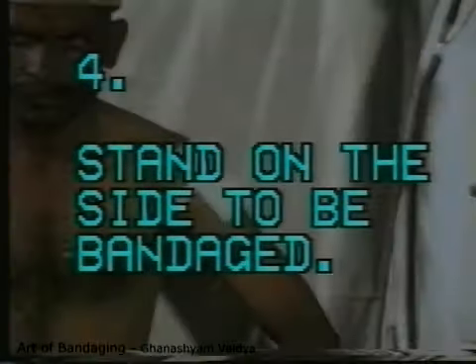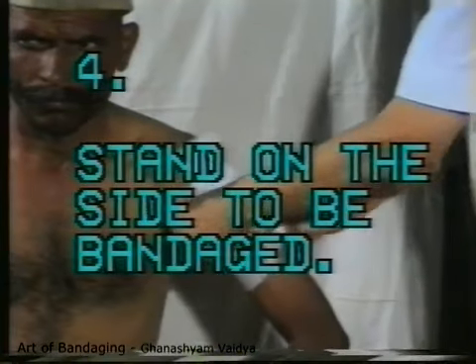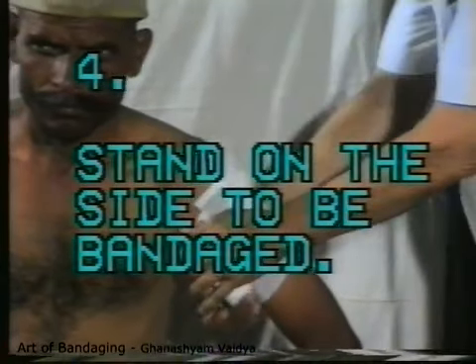You should stand on the side to which the bandage has to be applied. If you are bandaging the left side, stand on the left side. If you are bandaging the right side, stand on the right side. But do not bend over the patient. The bandage should be dry. After completing the dressing of the wound, always dry the surrounding area over which the bandage will be rolled. Never apply a wet or a damp bandage, as it will shrink after drying and constrict the part.